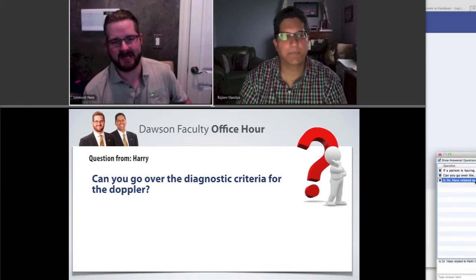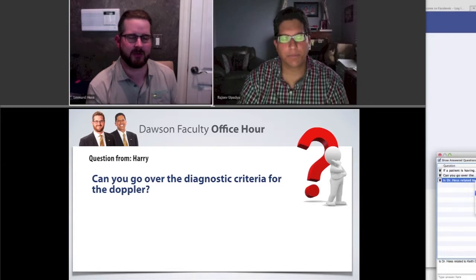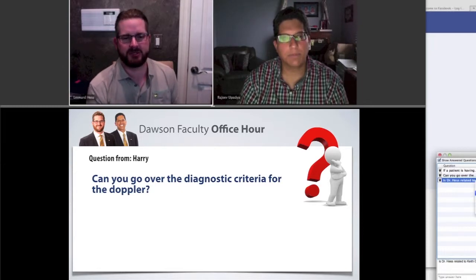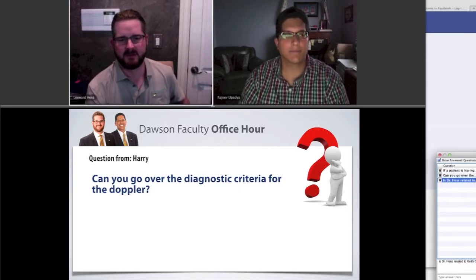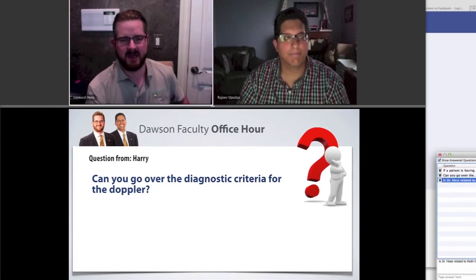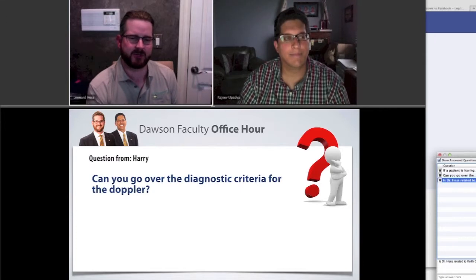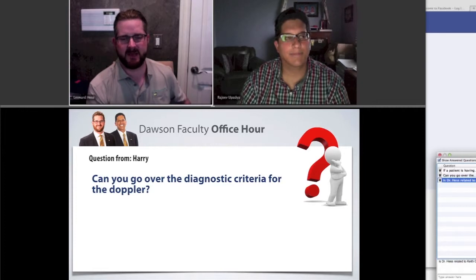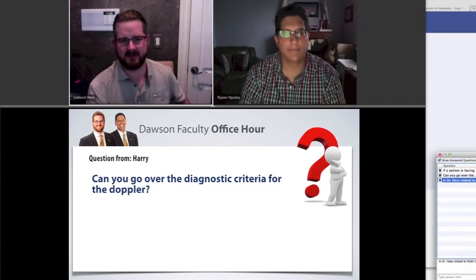When we start to use that Doppler, one of the first things we do is try to identify and place the head of the Doppler into the proper location in that little area right behind the distal area of the joint. What we start to listen for is vascular sounds. In that distal joint space, we have the arteriovenous plexus — the superficial temporal artery and the temporal vein feeding into that distal joint space. So we identify where we need to be by listening to our venous and arterial sounds in that distal joint space.